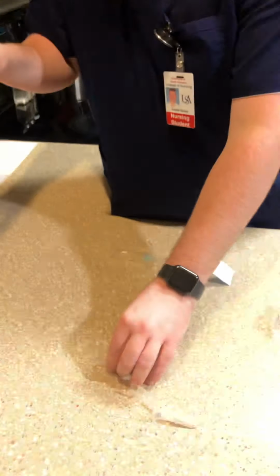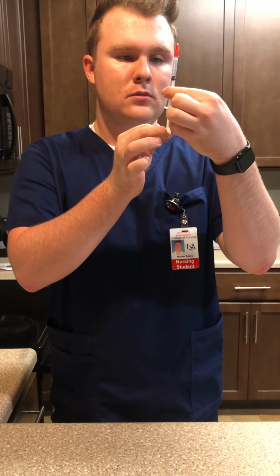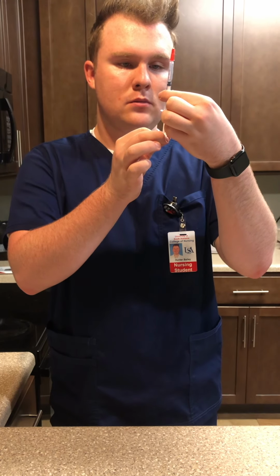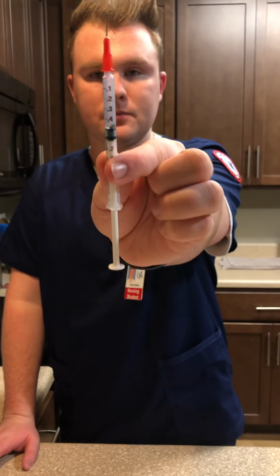I can move this to the side. Since I will be giving half a milliliter, I'm going to draw up air, half a milliliter. You can see that this is half a milliliter.